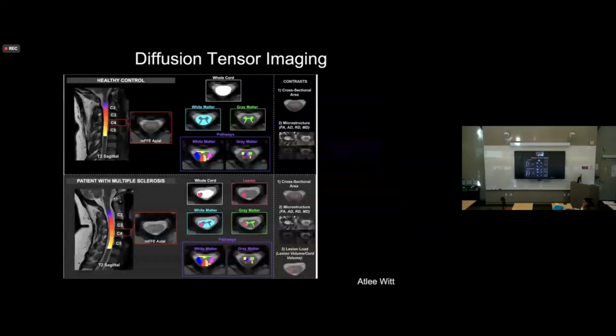And we've been able to move that needle quite a bit further now, thanks to the Spinal Cord Toolbox, which is quite possibly one of the most awesome tools brought to the spinal cord community. It allows us to start looking at diffusion phenomena in the white matter, in the gray matter, in the different funiculi, at different levels, and to register all of that together and look at lesions and how that changes. So a lot of the analysis methods developed over the years are coming together to really power our ability to study diffusion in the spinal cord.